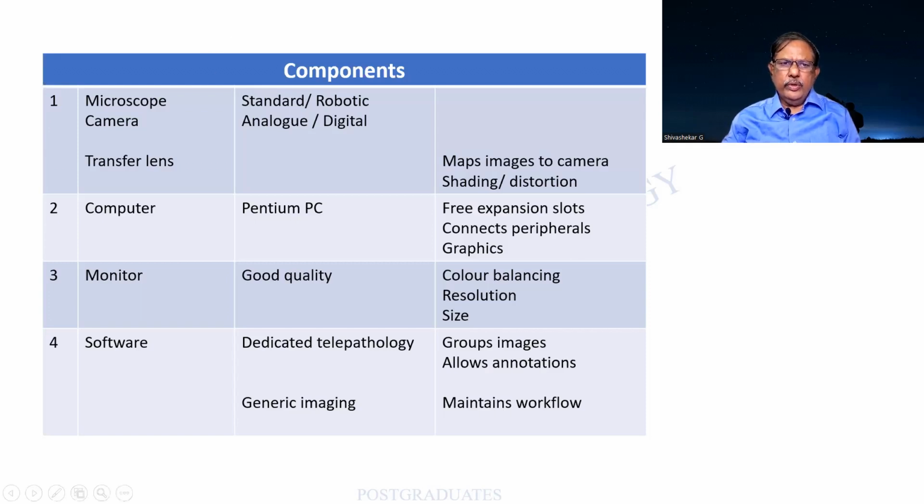So this is over here. Again, the components are mentioned. I would like you people to kindly go through it. For example, here the monitor. It is able to balance the color, resolve, and change the size also.